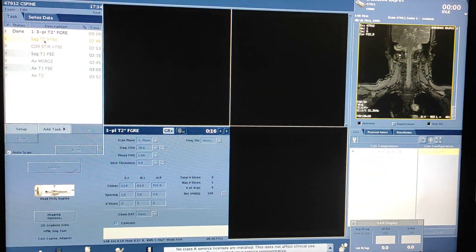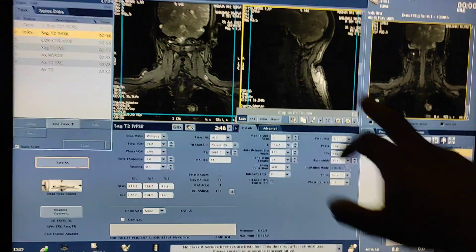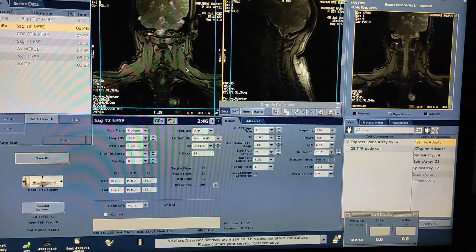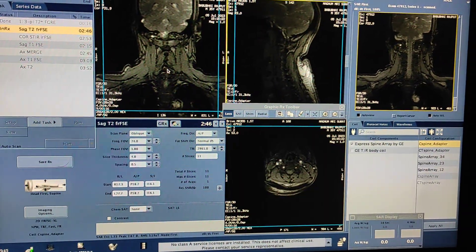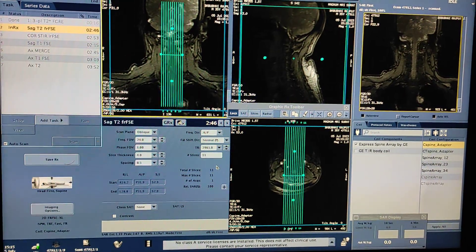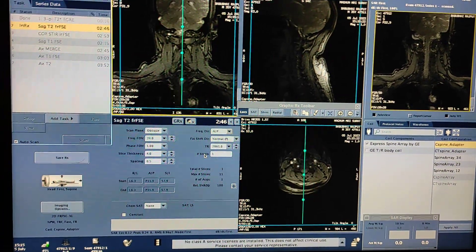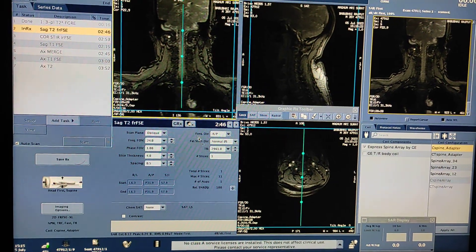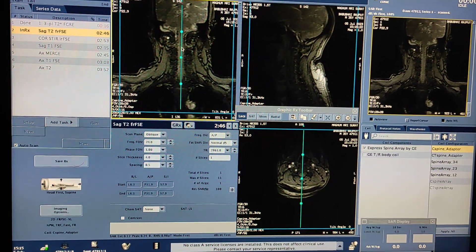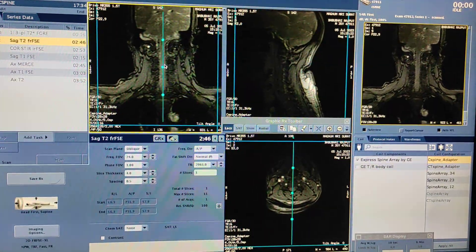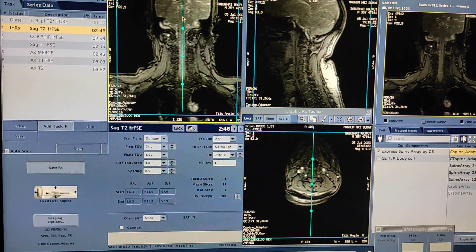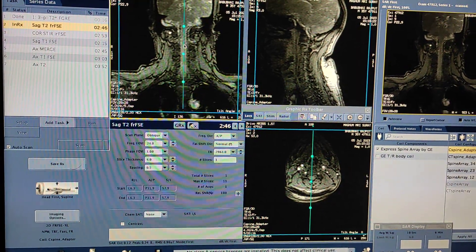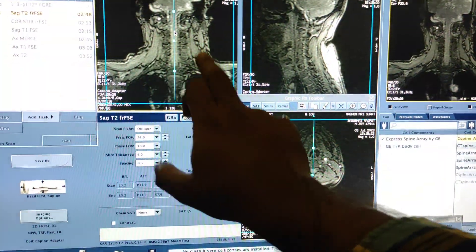First of all I am taking SAG T2. Double click to open. The rule is: if you want SAG, you have to plan on coronal and axials. But for SAG T2, I will mostly plan on this coronal image, because we have to plan one slice first. Click on 'single slice' and keep it on the spinal cord — your one slice should be parallel to the spinal cord.